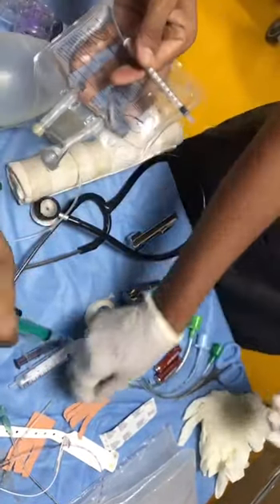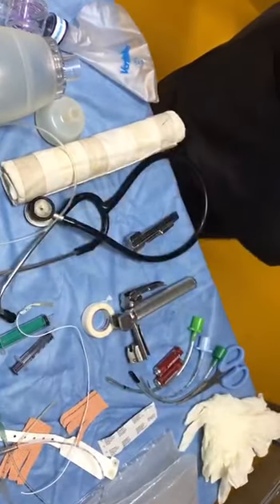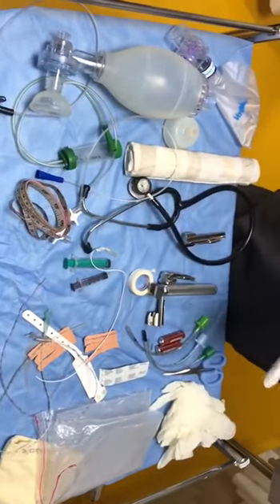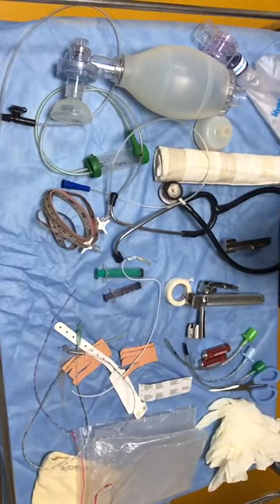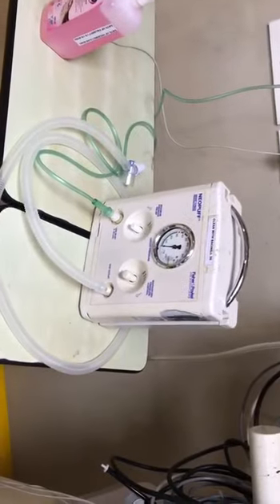Yes, sir. Please, sir, keep it ready. Okay, and medications fine. I hope I have all the equipment checked and I think everything is in place. And if at all the baby needs some CPAP, labor room CPAP, we may have that. We can use the T-piece resuscitator also. Hope we are ready now.